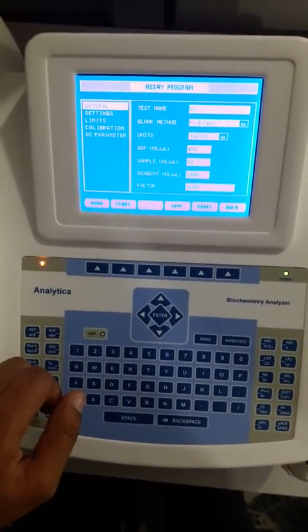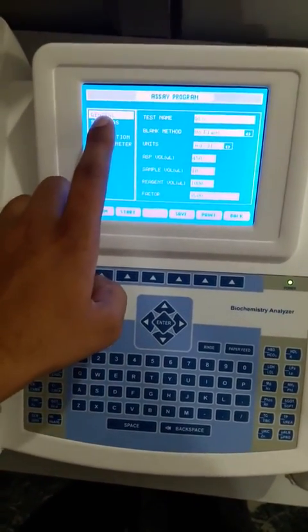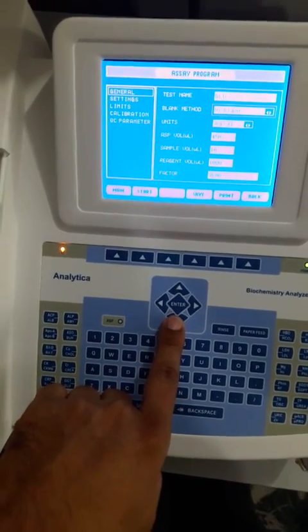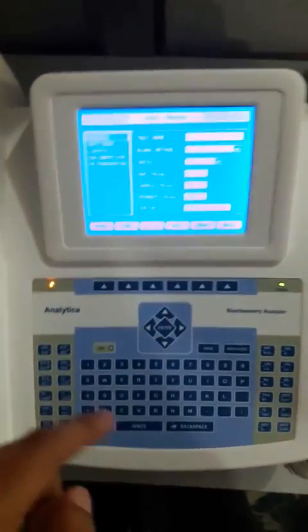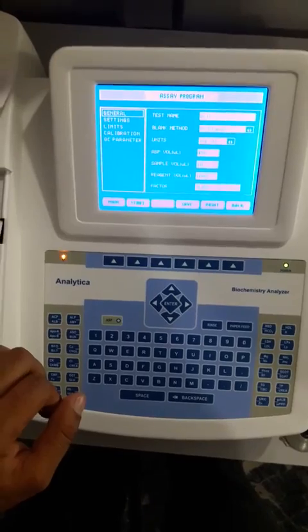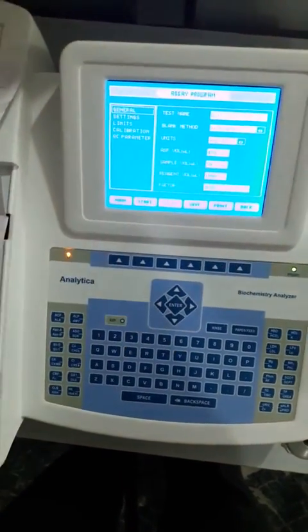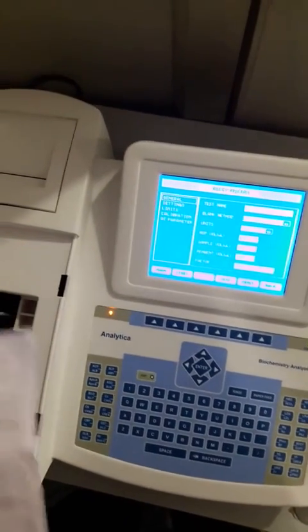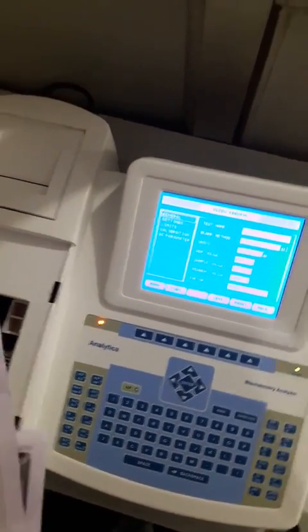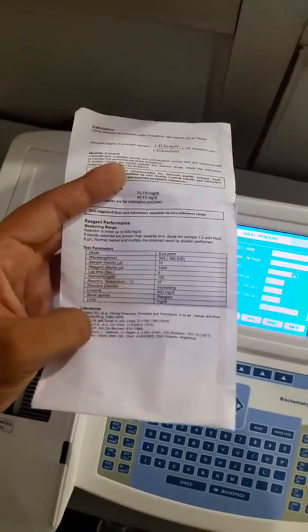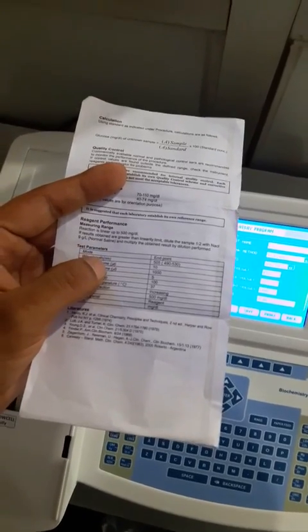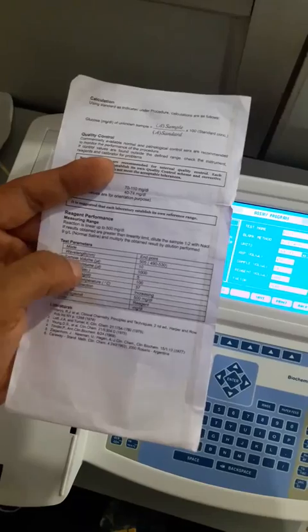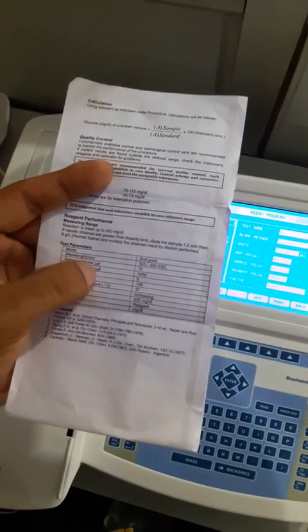It is now showing options like General. In General we can select the test name and other parameters as per the literature. First we will look at the literature available with our reagent kit.